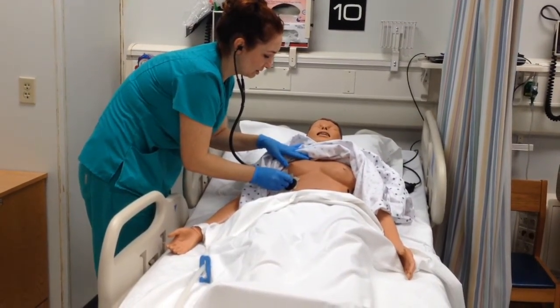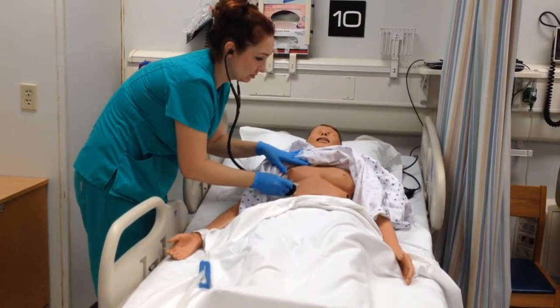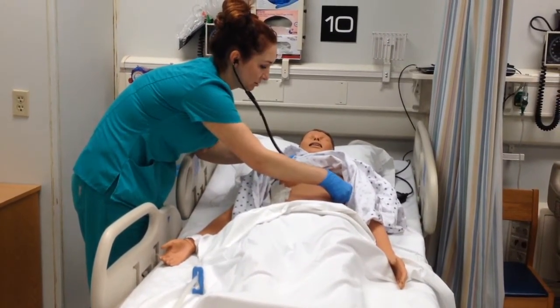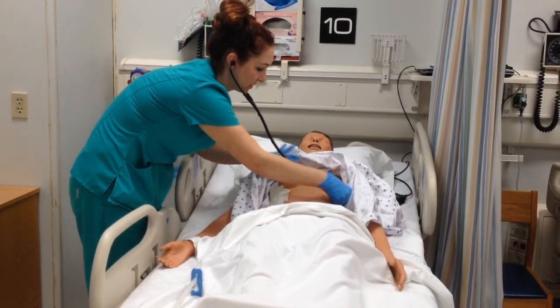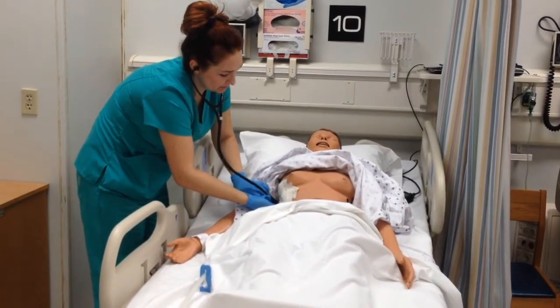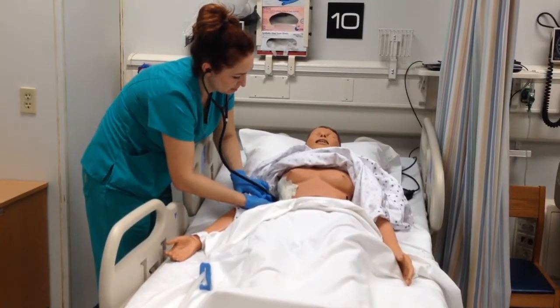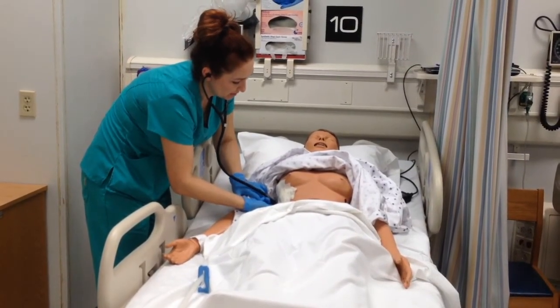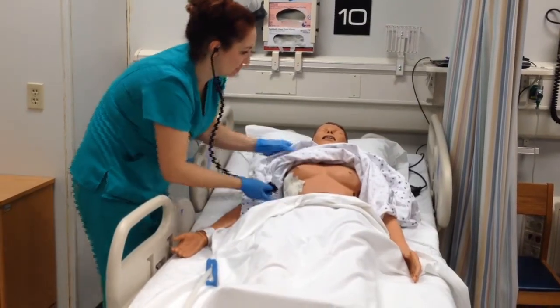The lung sounds are slightly diminished on the right lower side, which is to be expected with a chest tube. Checking the right middle lobe for breath sounds — deep breath in and out please. Breath sounds are slightly diminished, which is to be expected with a chest tube.